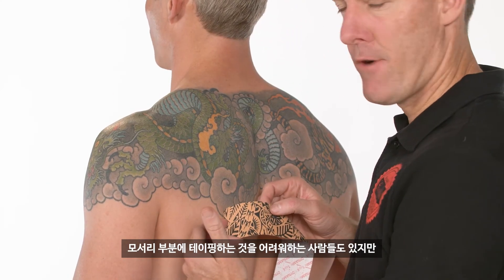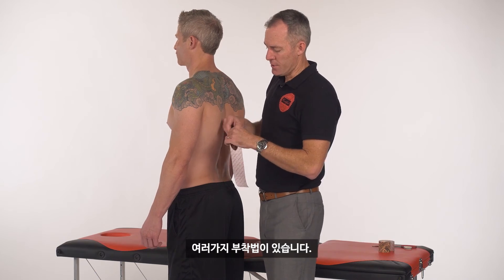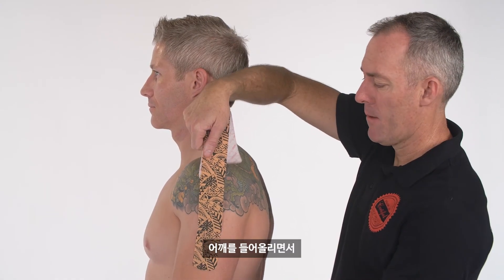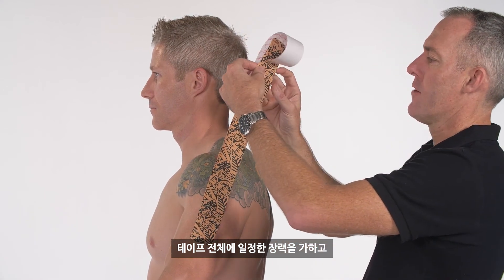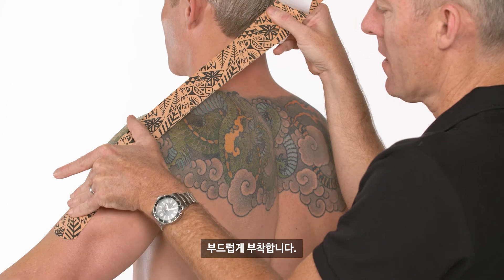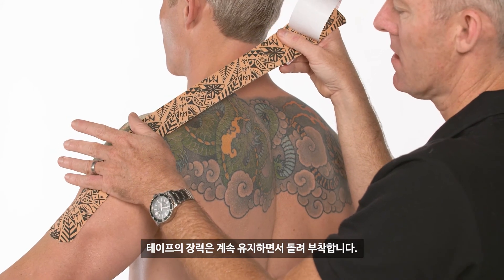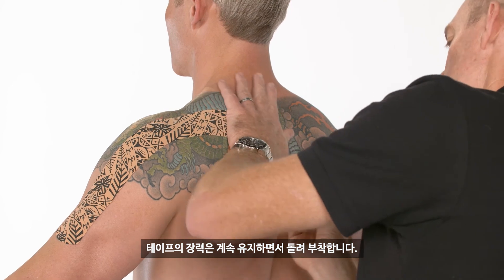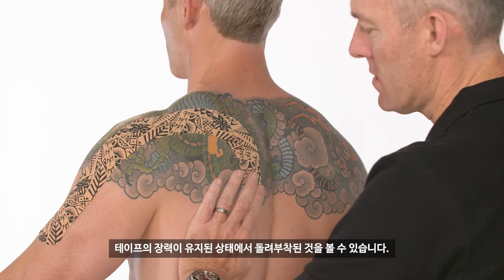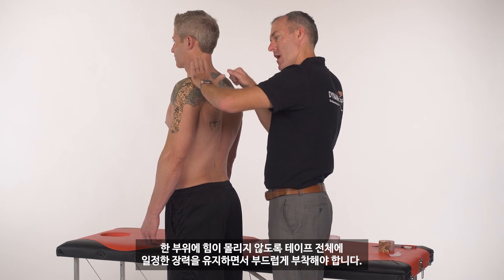Often people have some difficulty getting around corners with dynamic tape. The four-way stretch means we can go right around almost to a full circle, but there is a trick to it. The key is to make sure you have your tension on the tape nice and uniform, and then smooth as you go — smooth it down, let go of the anchor point once you have sufficient tape in contact with the skin, and keep the tension on as we turn around. You can see we can do it pretty much a full circle without losing tension — maintaining our force without the tape bunching up as we go around. The trick is: maintain tension and smooth as you go.